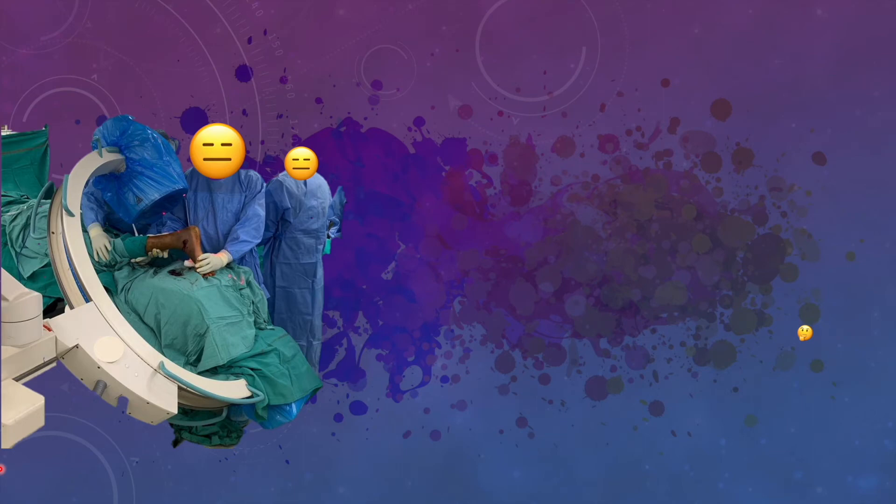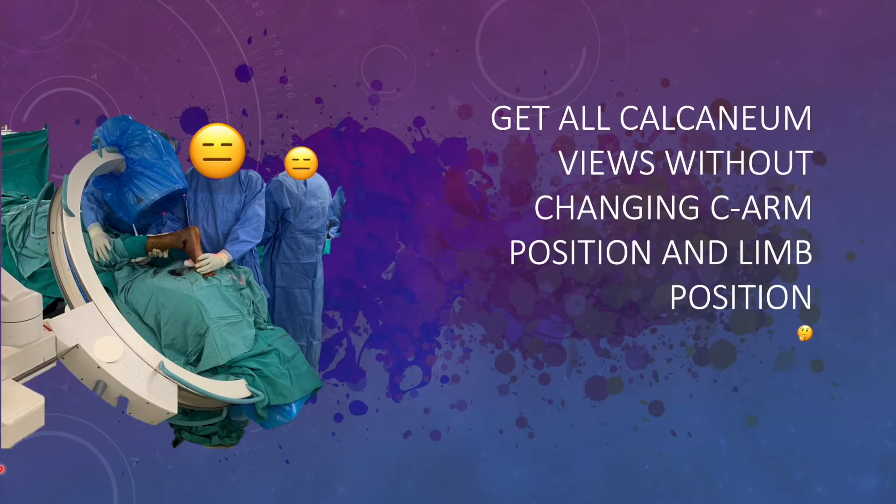Hello friends. In my last video I had shown you the basics of fluoroscopy around the calcaneum — how different fluoroscopic views look and what is the mechanism of those views. In this video, I will be showing you the basic technique in which you can easily get the required fluoroscopic views for calcaneum during operative procedures.